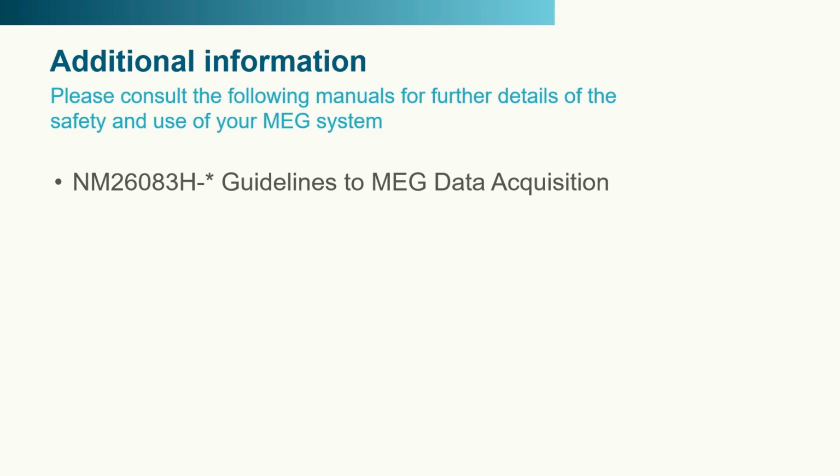This demonstration video was prepared according to Megin's Guidelines to MEG Data Acquisition. Please refer to this document for additional details and safety information.